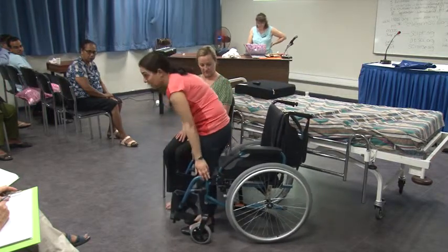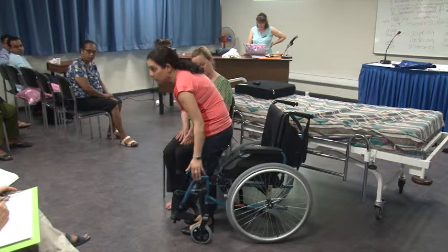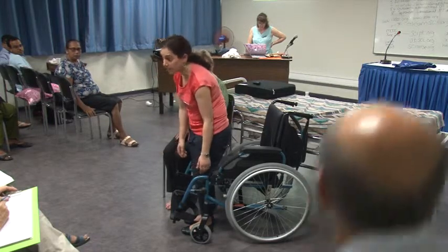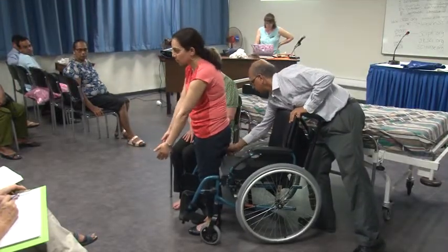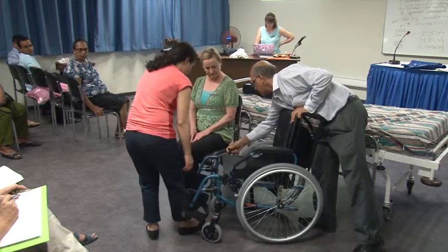Again, foot plates have to come off because you want to make it clear for the person to be moved around. So if the foot plates of the chair don't come off, it's a problem. Especially if they are also sticking out, it's a big problem. You're going to make the transfer very, very risky for the patient and yourself. So you take the foot plate out as well.